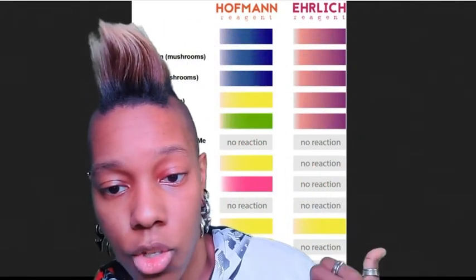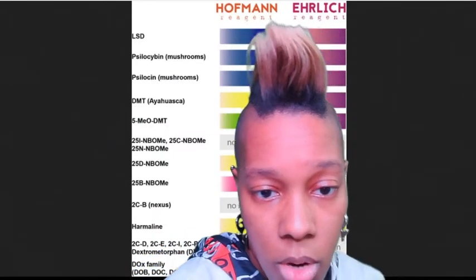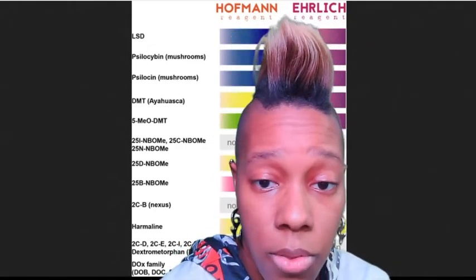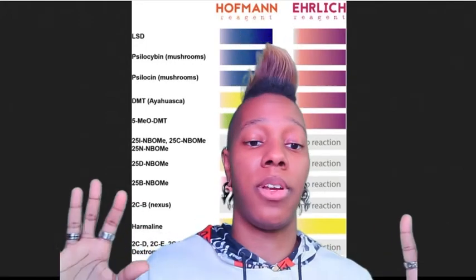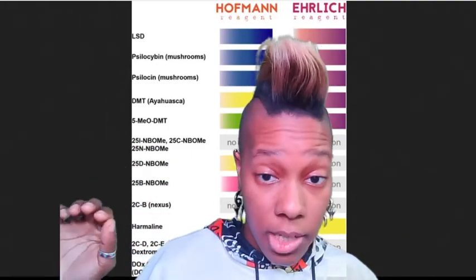And then again, there's no reaction on these 2C family of chemicals, which are also psychedelics, or the DO family of chemicals, which are also psychedelics with their phenethylamines, which are usually psychedelic amphetamines, and definitely not tryptamines, and definitely have different effects. So, if you are testing for LSD and you get no reaction, basically you're like, okay, there is no LSD on this blotter. There might be something else, but there's definitely no presence of LSD here.